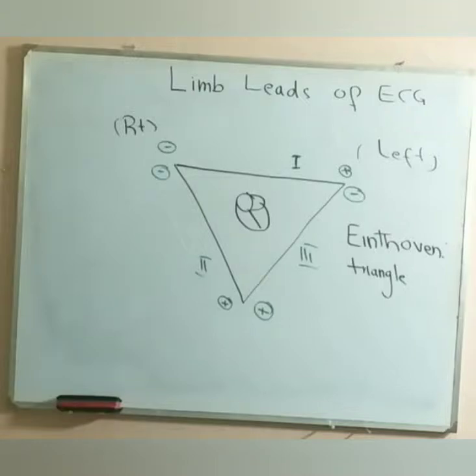And historically speaking, parallel to this historic event in 1903, the Wright brothers were actually trying to devise aeroplanes, and in the Second World War these were used. So these are historically parallel events which were going on. So in 1903 this person devised a machine, and from his name we know that this triangle is Einthoven's triangle.